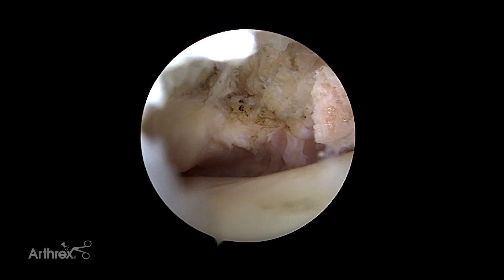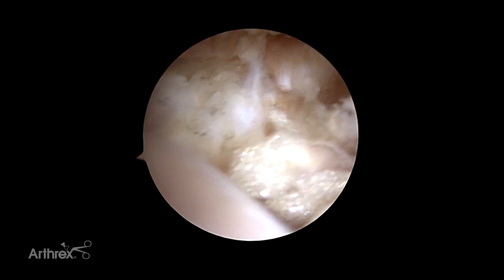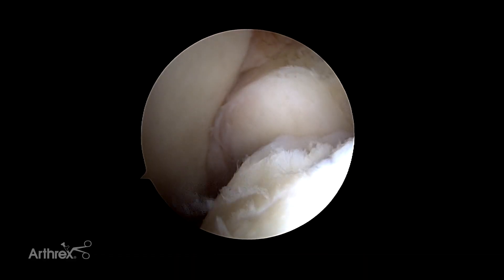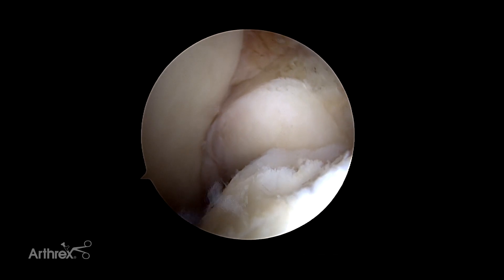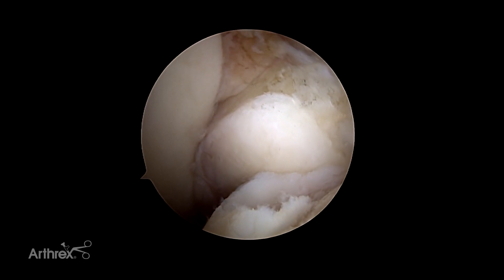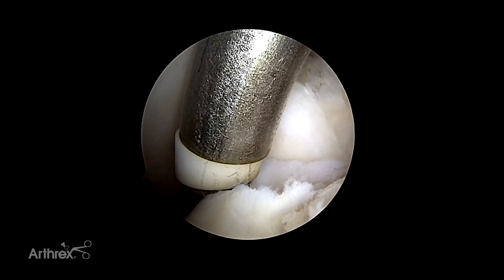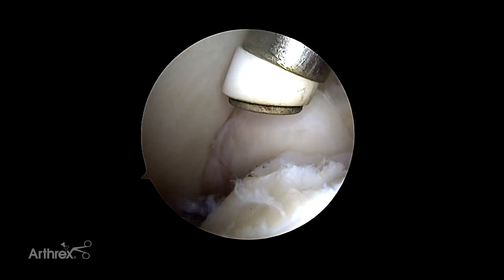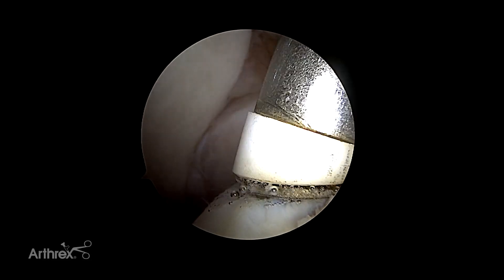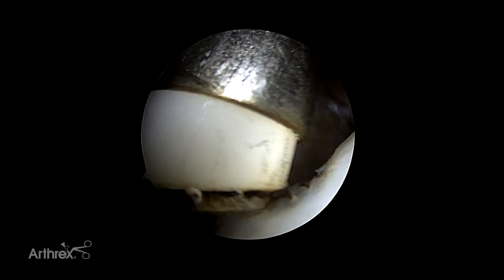This person has a cartilage lesion — an anterior lateral OCD, which is not uncommon. After we've done our microfracture, a lot of times we'll have rough edges left. This is another place for the SJ50: now that you've microfractured, you'll notice we have rough edges right in here and we worry about those breaking off. Instead of putting a shaver in, one of my favorite tricks is to bring the SJ50 in and with the coag just slowly, gently hit these areas — it takes off any of the rough edges without hurting the cartilage.